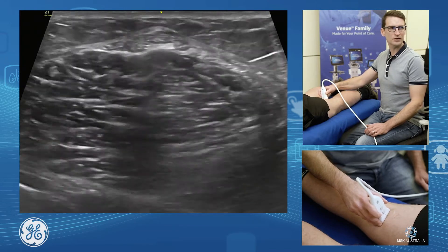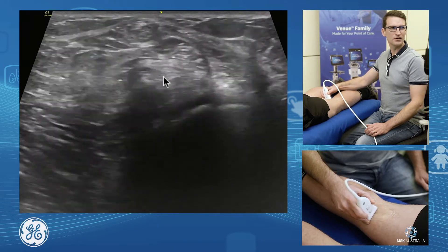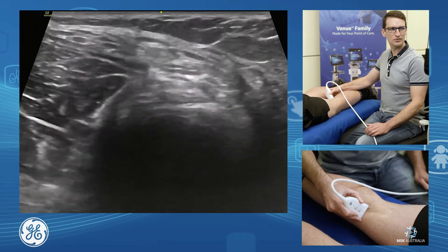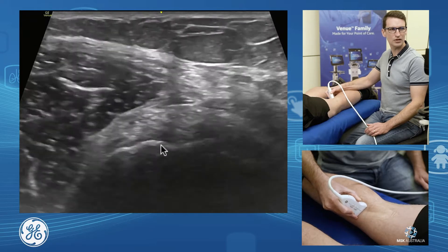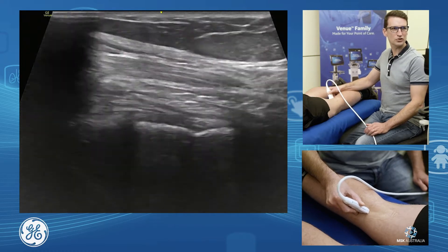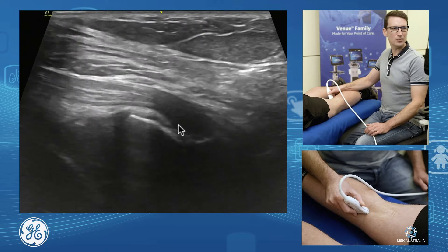As we follow that down, we'll start to have our semi-membranous form its tendon, and we can see there continuing down — that's our semi-membranous and semi-tendinous tendons. Our semi-membranous comes down and inserts onto our tibial plateau. It's got a direct arm which comes straight on. It's not a very nice tendon to scan because it actually has five separate arms all shooting off in different directions, so we can sometimes pick up a bit of anisotropy and irregularity there.